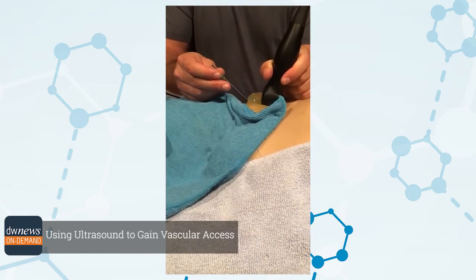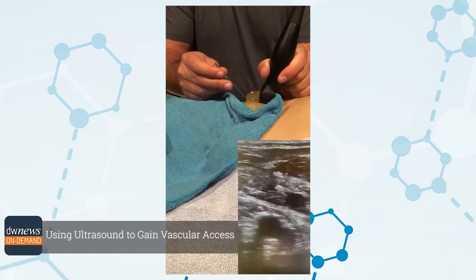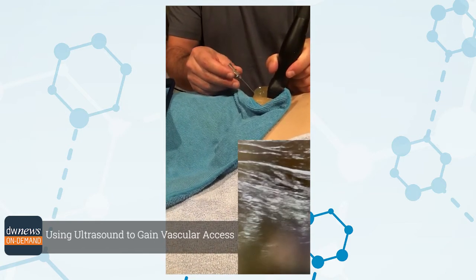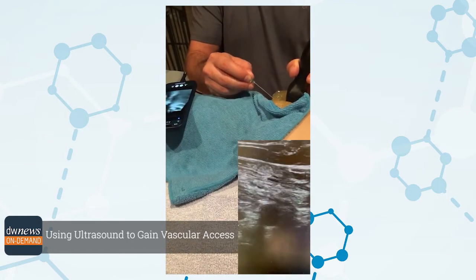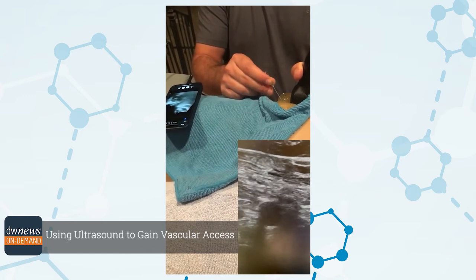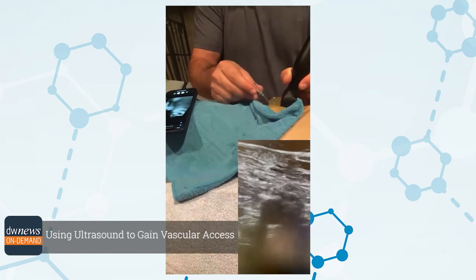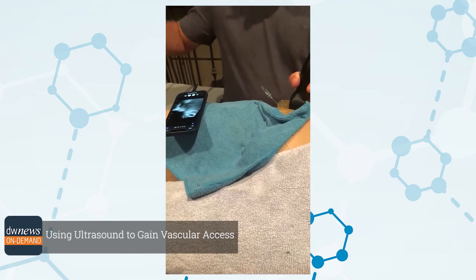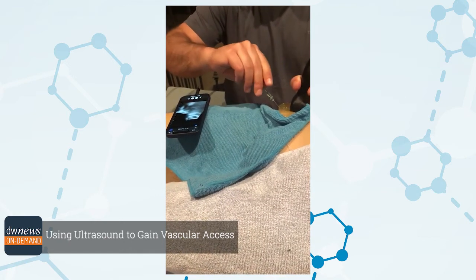On my way in, first when I go in, I actually go back and forth on the skin so I can see that I'm in the right coaxial axis. Then what I do is I adjust the needle angle — I can definitely see the needle tip by ultrasound here. This model is a little bit thick and this is obviously a simulation. This is a modified Seldinger technique.